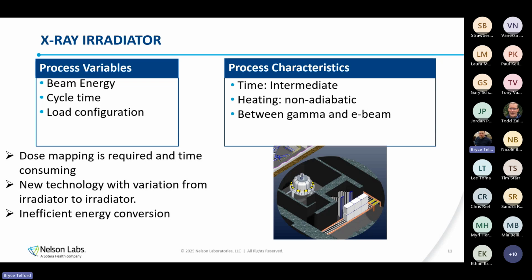So it's like an incandescent bulb in that aspect. With an incandescent bulb, we throw a lot of energy in, we get a little bit of light out. Sort of similar with X-ray, we throw a lot of energy in, we get a little bit of X-ray out. That lack of efficiency does tend to lead to some additional costs associated with X-ray. So that's your three modalities.